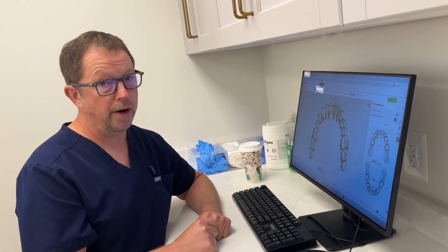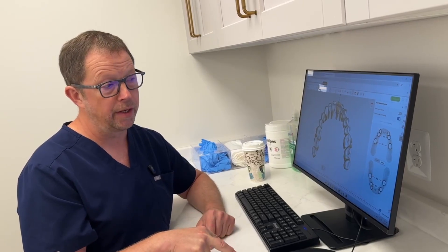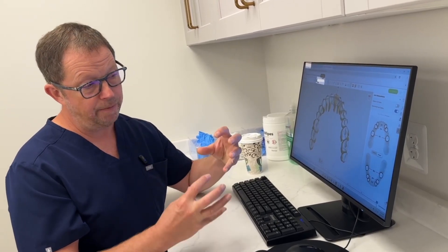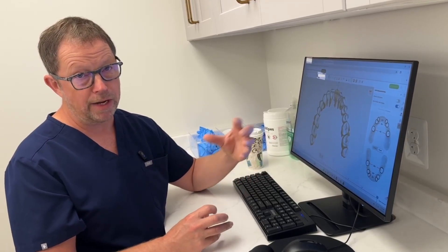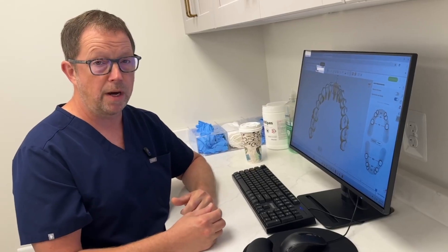We start with this sort of analysis. Round one of aligners involves bone-level expansion — getting the lower jaw to 38.3 millimeters and the upper jaw to 41.1 millimeters, keeping the teeth moving with the bone-level expansion. Then we'll do a second round of aligners after that's done to look at the top, get any refinements done, look at the bottom, and achieve good occlusion top to bottom.